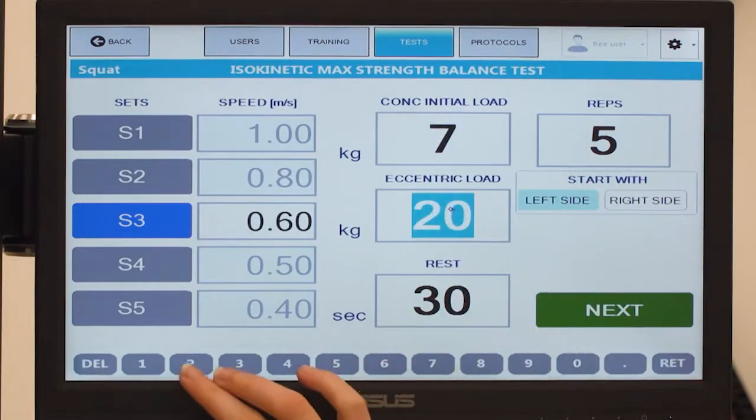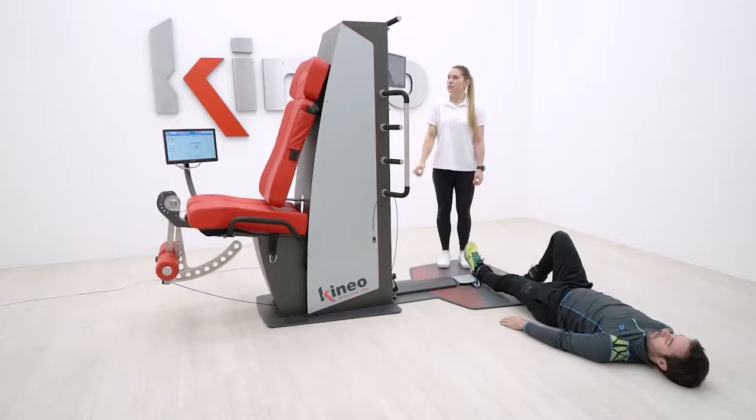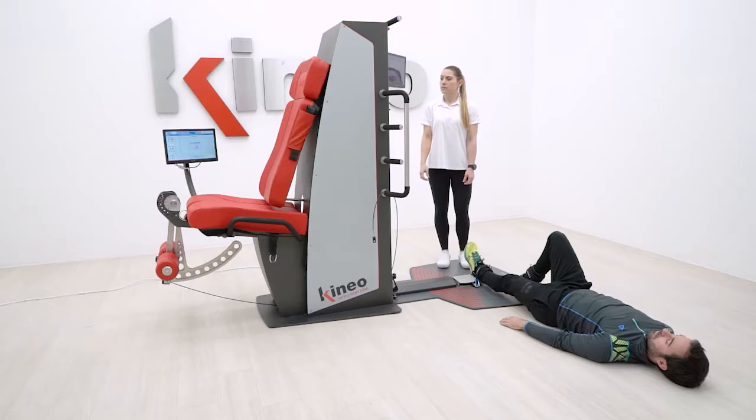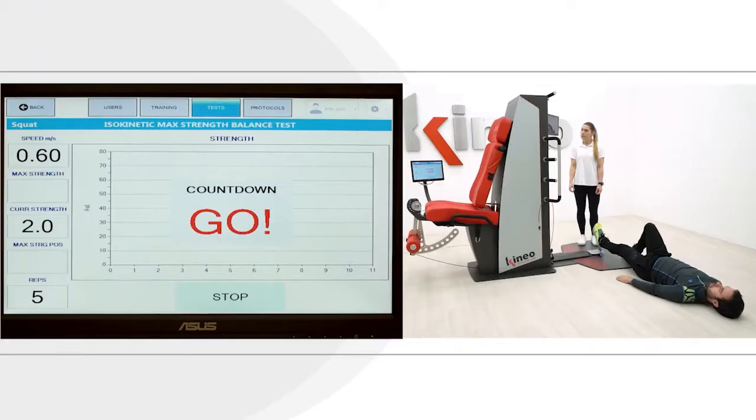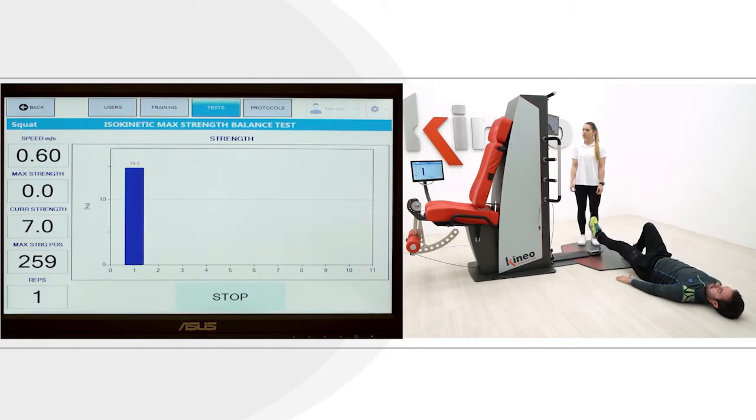While lying supine on your back with the cable attached to the ankle, the balance option will test the non-injured lower limb first and then the other limb during a concentric maximal contraction, in isokinetic modality with the knee completely extended.